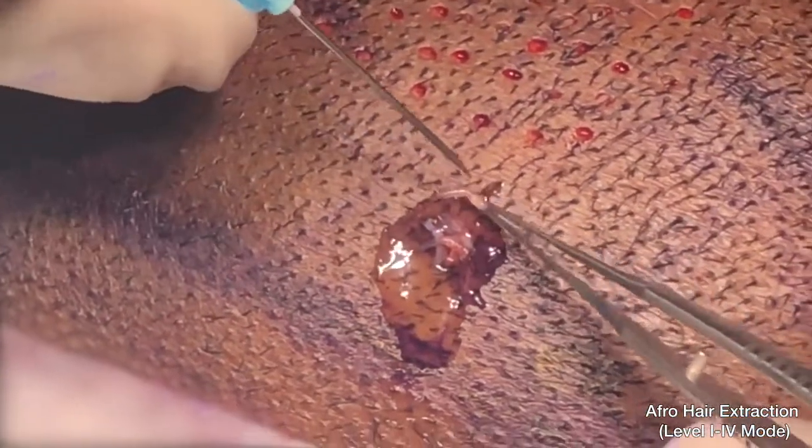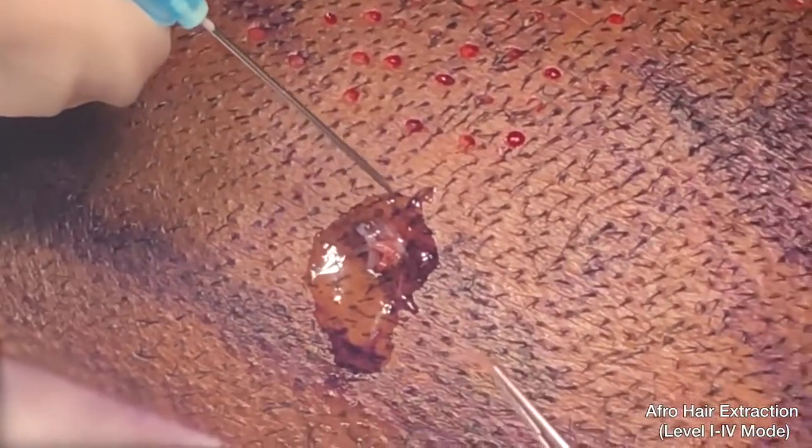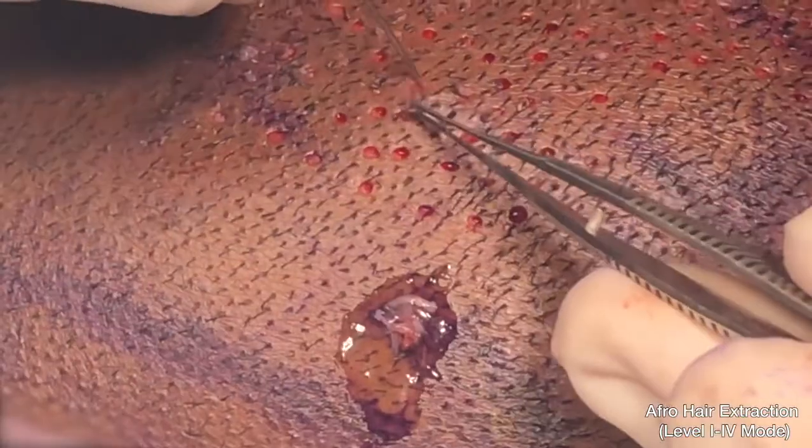At the end, we have a number of grafts that came out. As we can see, they are all intact with their connective tissue sheet around them. They are not excessively splayed. Excessive splaying is a sign of lower quality graft.